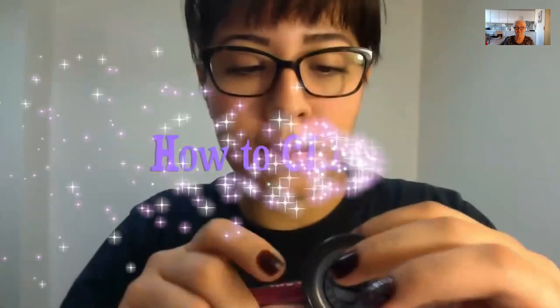Okay. And as far as cleaning, we should take this out of the ears. When it comes to cleaning your stethoscope, I usually use Clorox wipes, disinfectant wipes, or even alcohol wipes. Whatever you can find that is disinfecting or kills any type of bacteria. I don't suggest squirting stuff onto it, but if it's a wipe, it's probably better.